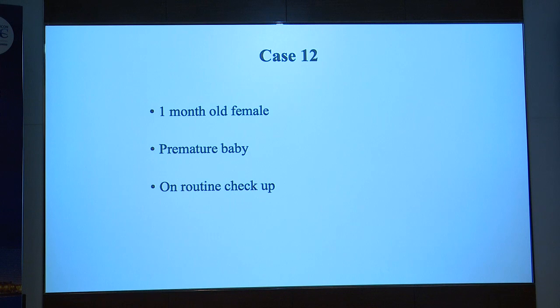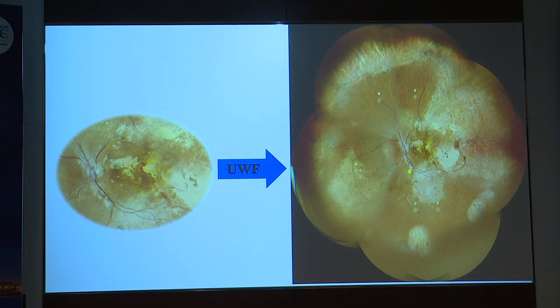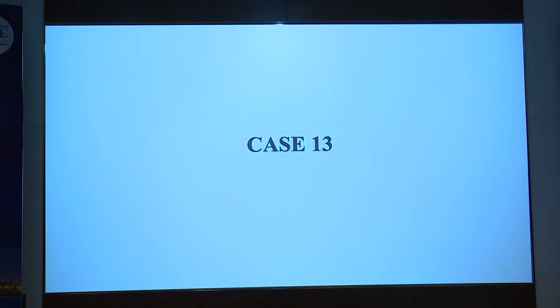Case number 12. Now she is a premature baby, referred to us for screening. Now look at this. This is the routine standard photograph which was taken by one of my colleagues. And when we did an ultra wide photograph, self-explanatory, retinoblastoma, multiple tumors with seedlings all across into the vitreous. This is so convincing to the patient that you don't need to speak to them further.